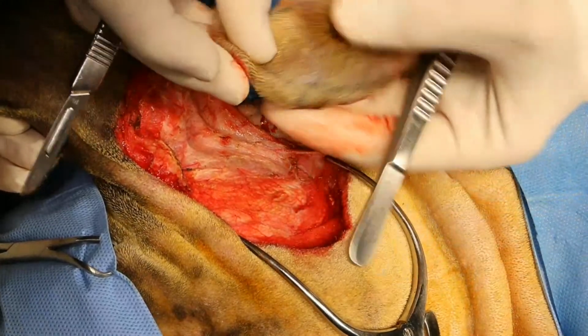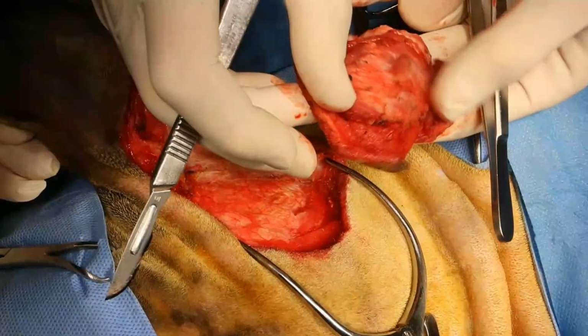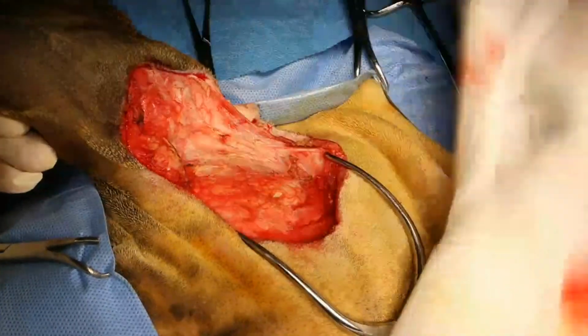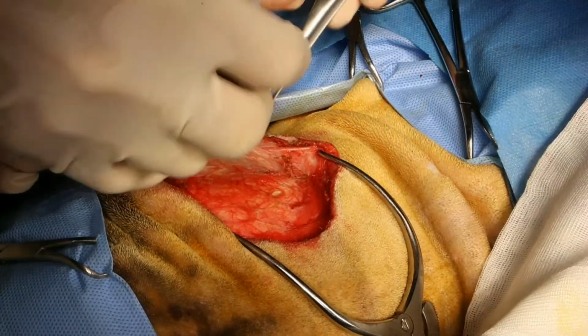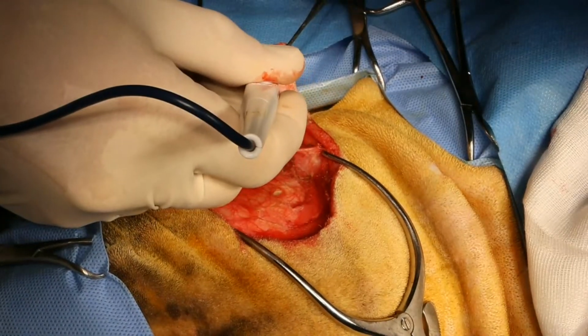Okay, so I feel really good about what we've done here in our margins, and so we've got a muscle belly deep to it. The risk here really is going to be if there's damage to all of the marginal vessels, in which case we may have issues with necrosis of the pinna. I don't think these owners would be too concerned if we had to do a pinna amputation.